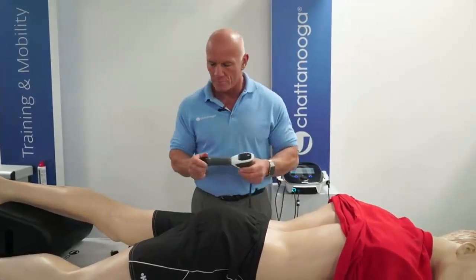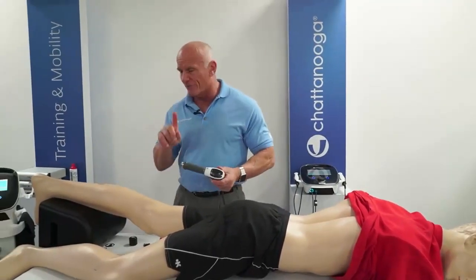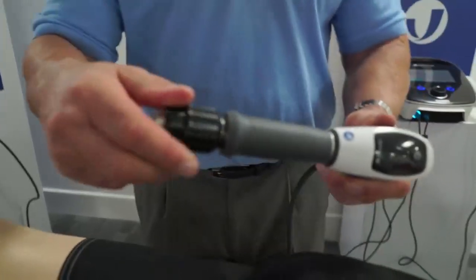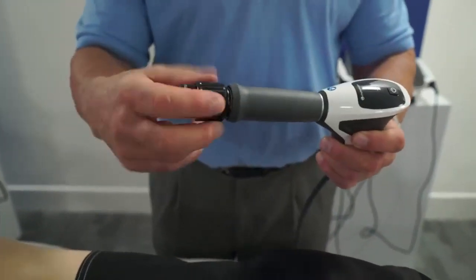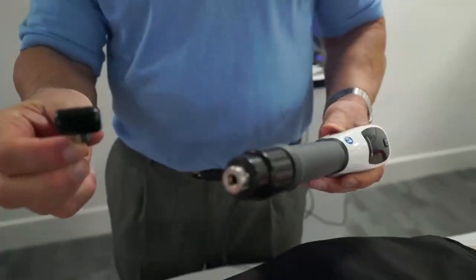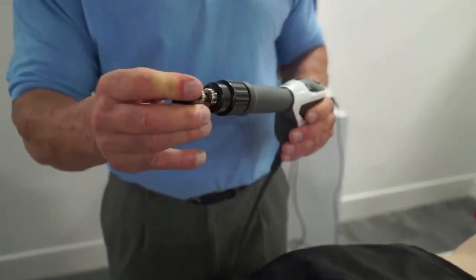And this is where we're going to start to use our new periactors. And it's a different technique from administering a radial pressure wave. We have an adapter, and these only work on the new Falcon handpiece. And we have a range of periactors. This one's called the scraper. Okay, and I fit that into my machine.